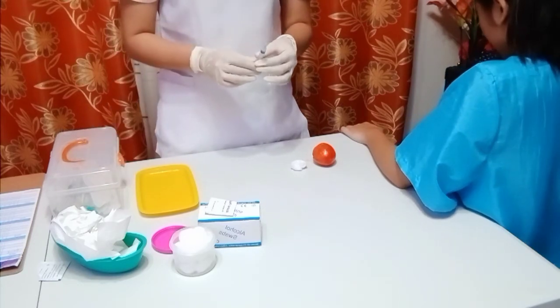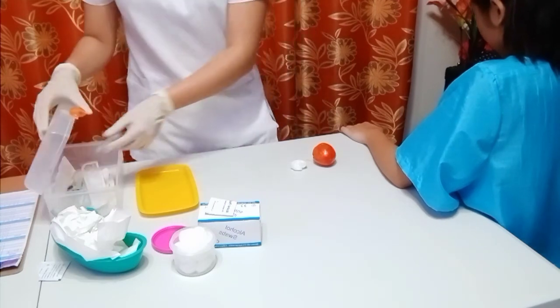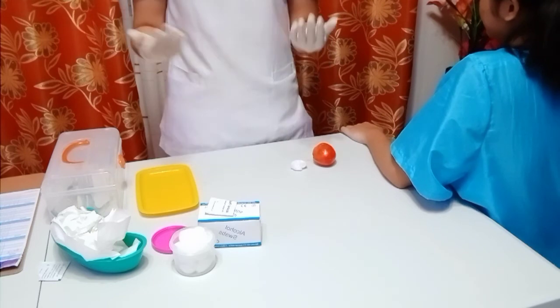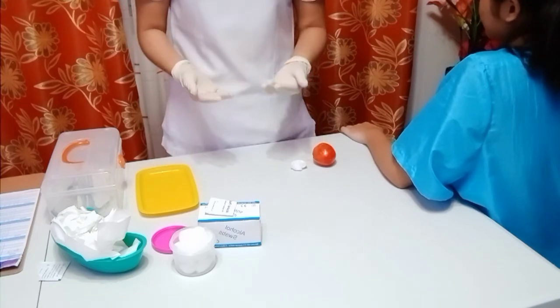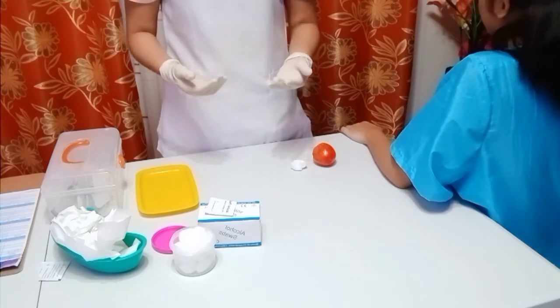Next is to discard the uncapped needle and syringe in a safe receptacle. Proper disposal prevents injury. Most accidental needle sticks occur while recapping needles. Next is to remove gloves and wash your hands.